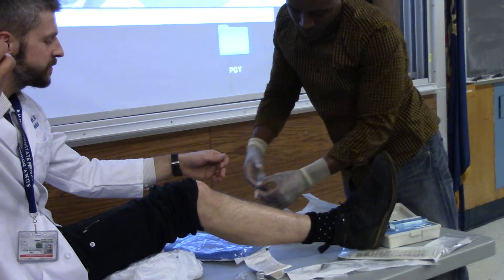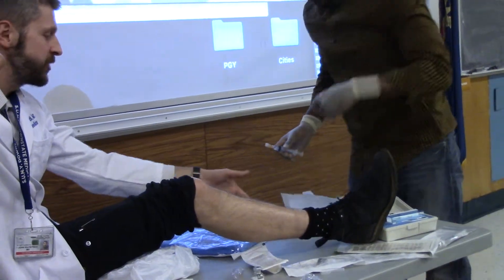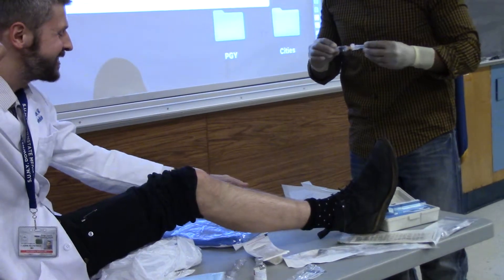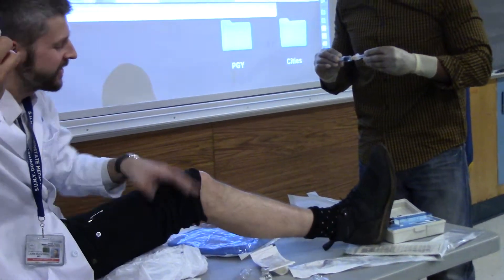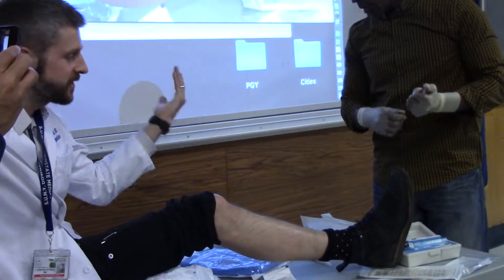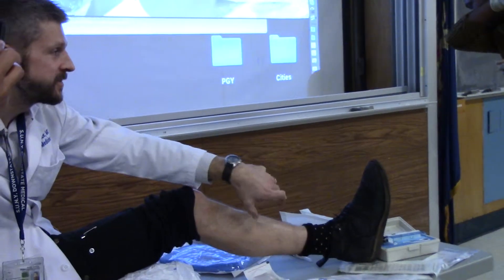It's probably not going to be deep. Ideally, I need posterior — deep posterior, superficial posterior here, and lateral on the side. And then the ones most involved in traumatic injury, because like when you're going snowboarding, it's going to be the anterior compartment.